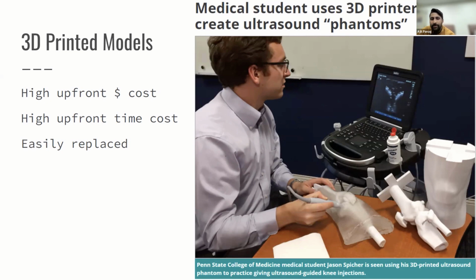They're easily replaced. This is an article from 2018 from Penn State, and it really makes me think about what I was doing as a medical student. This medical student out of Penn State created a proprietary 3D printed ultrasound phantom to practice ultrasound guided knee injections. He actually wrote the code for the knee joint that you see on the right of the image, covered it in some ballistics gel, and was able to create this proprietary model. Just looking at the ultrasound screen over there, it looks not bad. You can see it in the background of the image.